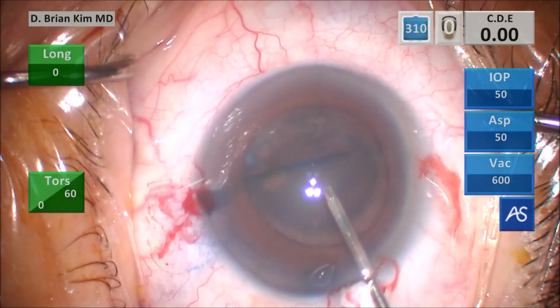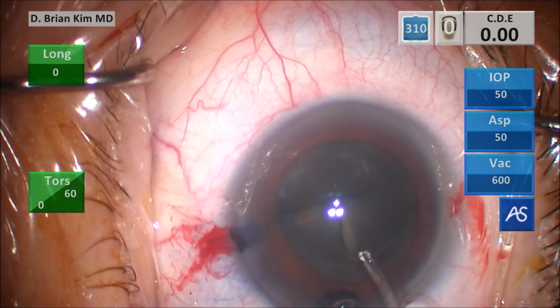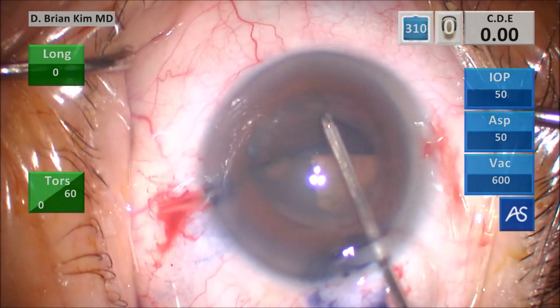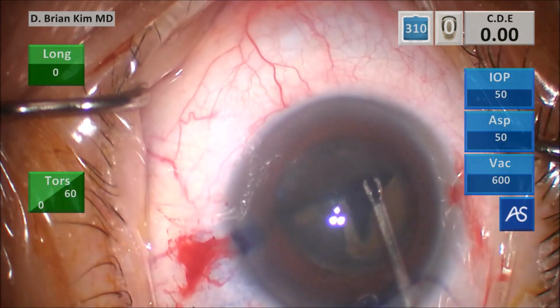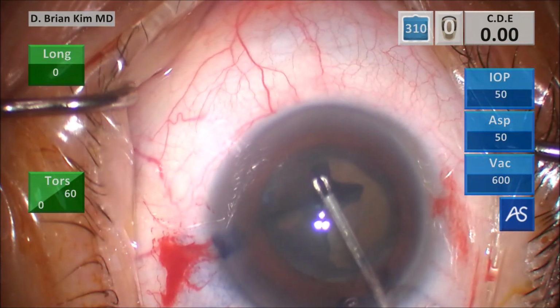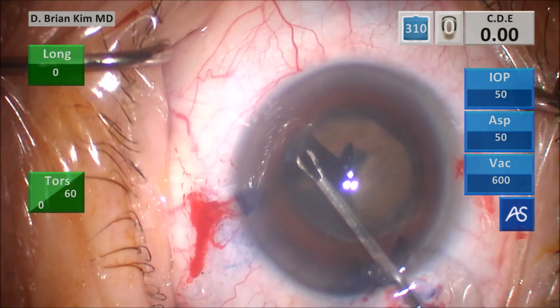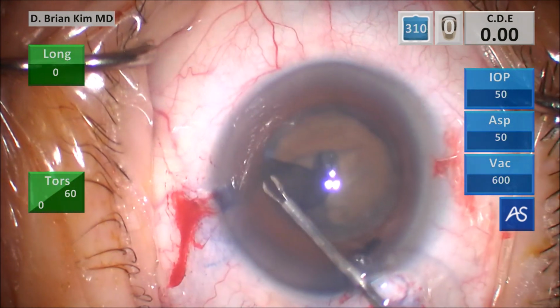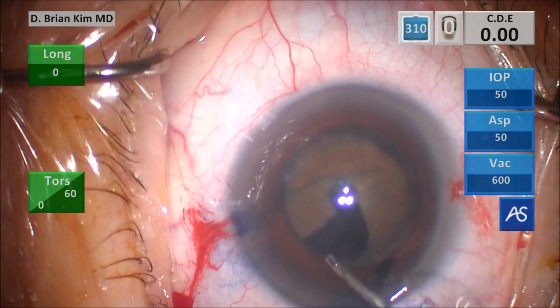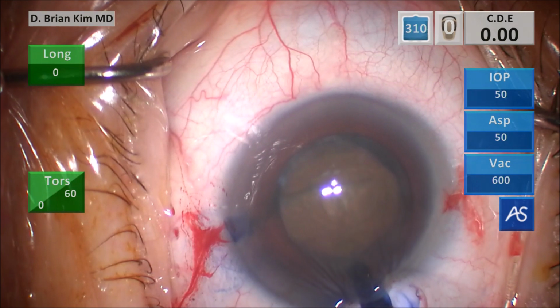And this is the Moria micro forceps. I'm able to puncture the center and pull down and grab the right side of the tear. The tips of these forceps are sharp, so they can function as a cystotome at the same time. Go ahead and go around circumferentially, grabbing and regrabbing. Again, these low profile rhexis forceps really give you excellent control. There's very little OVD egress, and as a result, little radialization forces with this forceps. Burping some viscoelastic out and the capsule out.